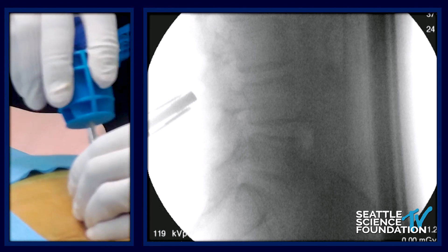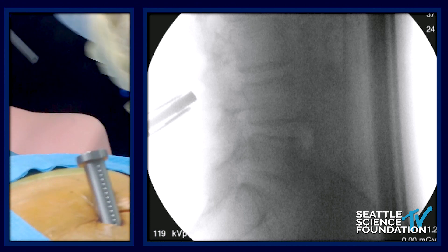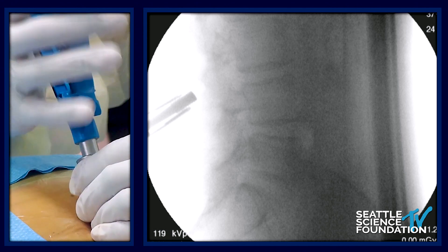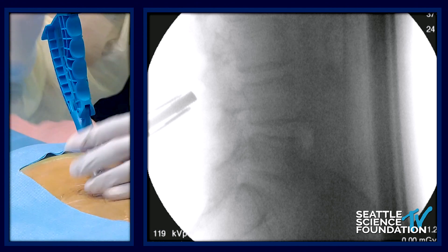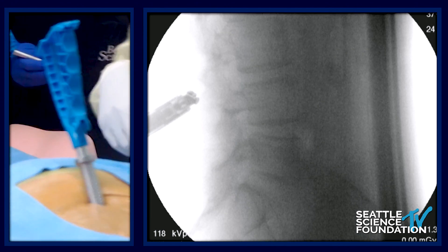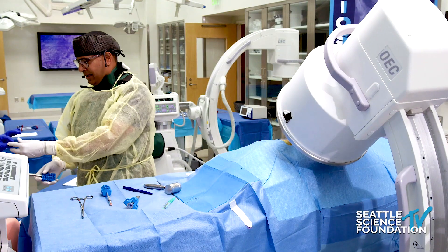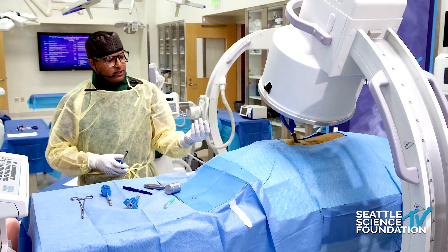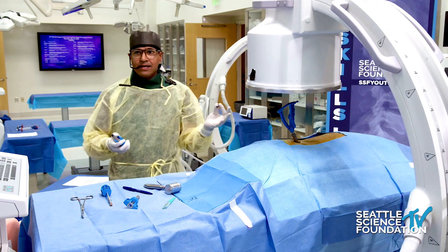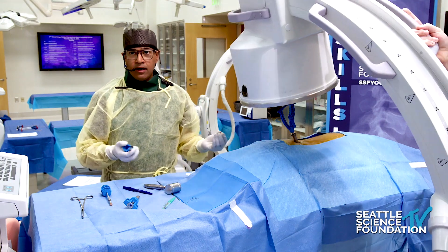I take my gauge, which measures the interspinous height — we look for the bar to bend up. That's a 12. We have five different sizes, 8 through 16 millimeters. The most common sizes are 10 and 12, even though the most common size from the IDE study was actually 14 millimeters, interestingly enough.